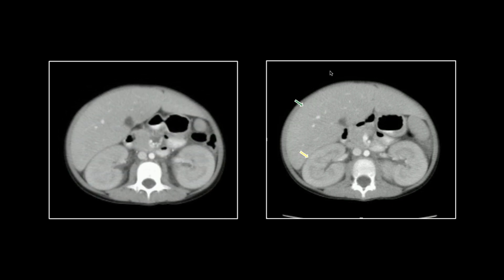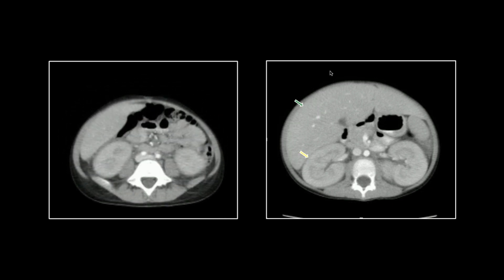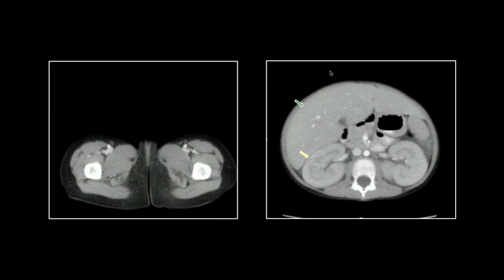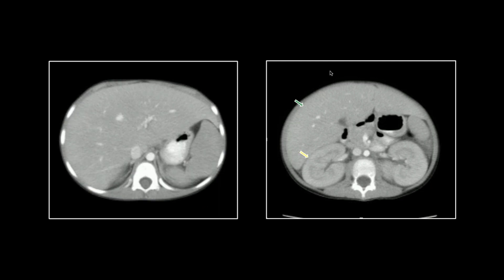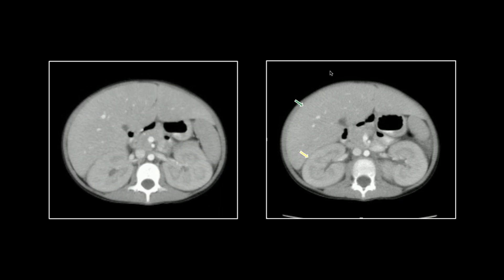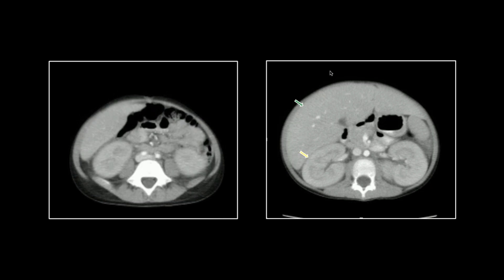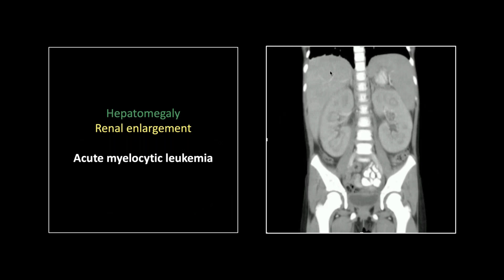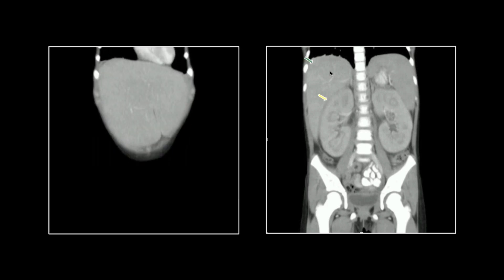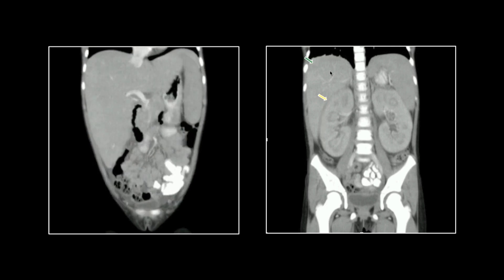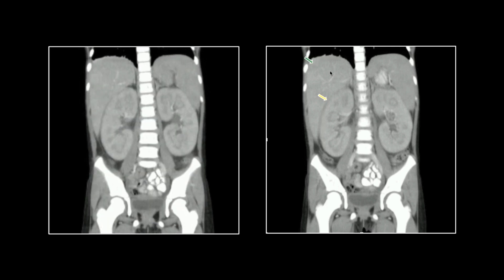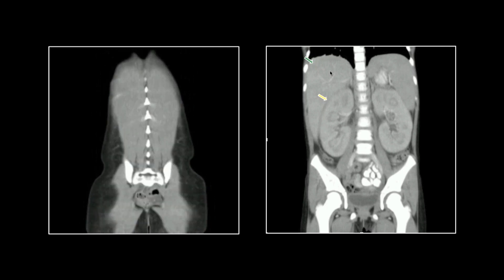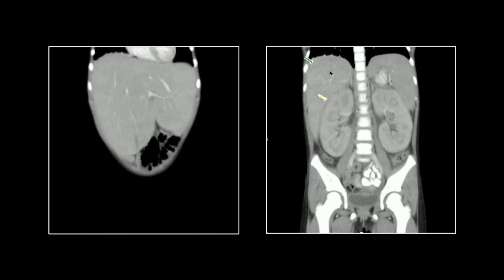The large liver looks pretty homogeneous — it may not be infiltrated — but those kidneys are striking. Again, look at the cortical thickening and the density within the pyramids. On the coronal you can see the massive enlargement of the kidneys and that pyramidal density. Pretty striking. That is a pediatric patient with AML.